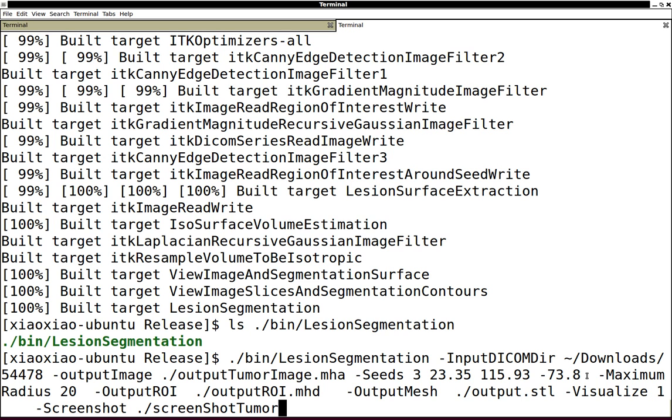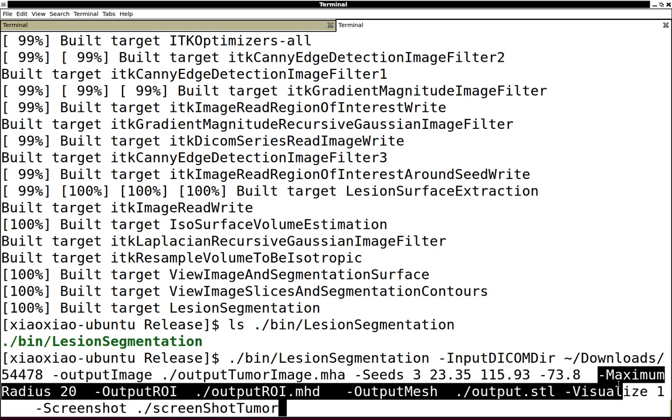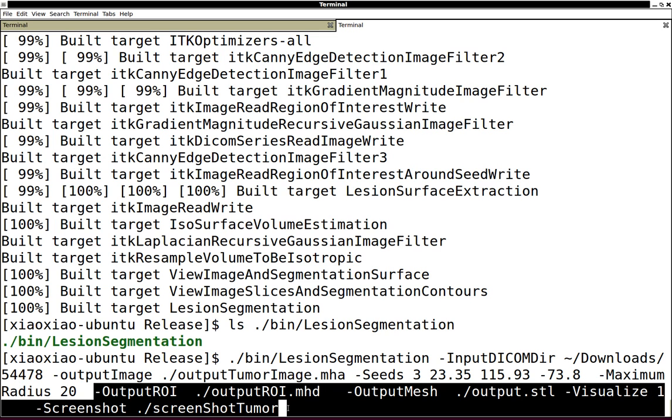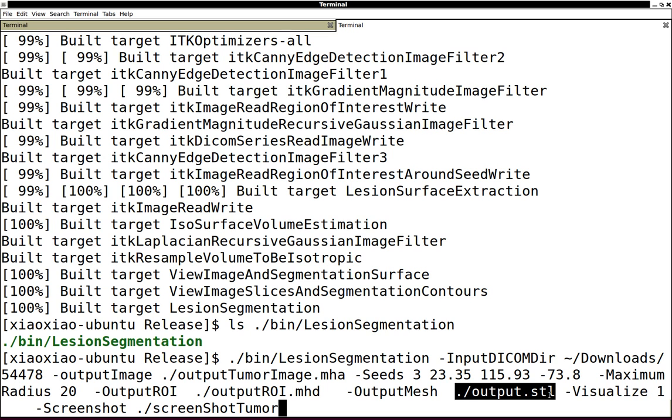Specify the radius, roughly how large is the tumor. If you want, you can also dump the output result. The most important thing is the segmented surface mesh of that tumor.